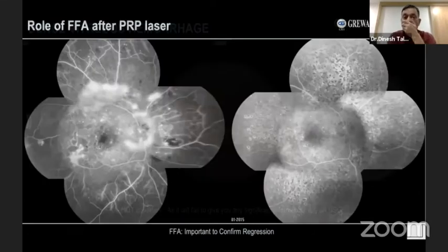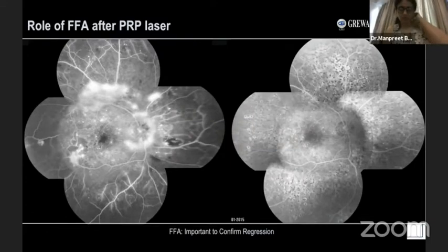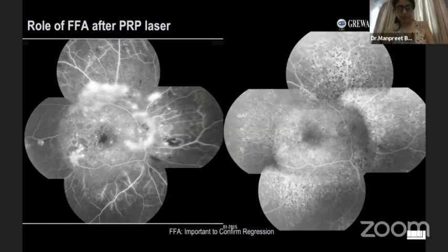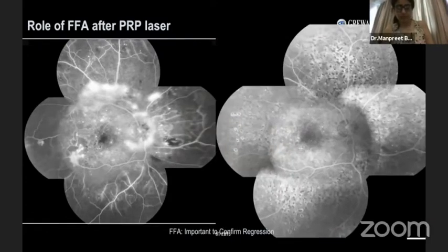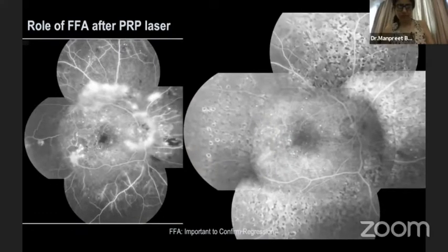Does fluorescein angiography have any role after treatment? At times, yes. It confirms the successful regression of NVE following PRP. This image is taken three months post-laser treatment. No new NVEs were detected, indicating successful regression.